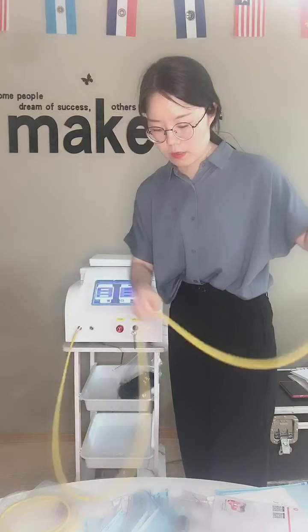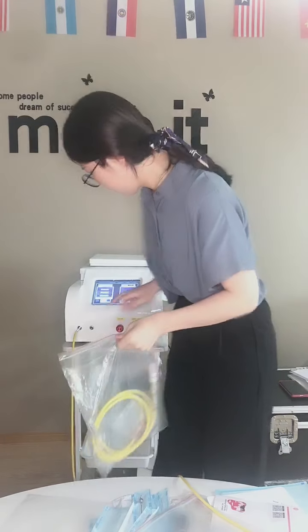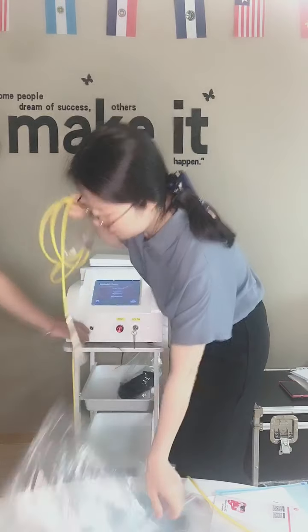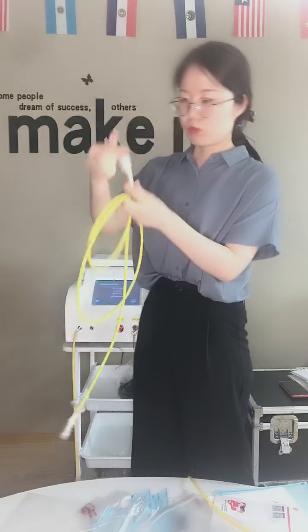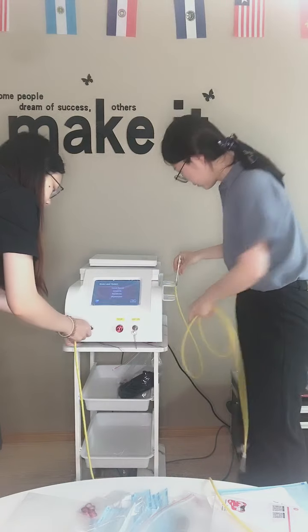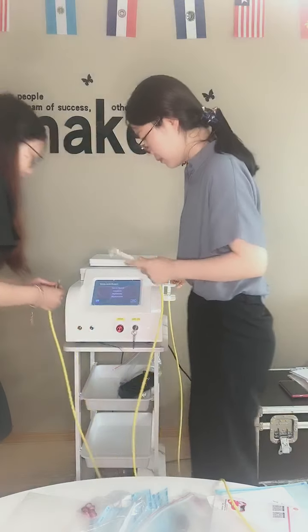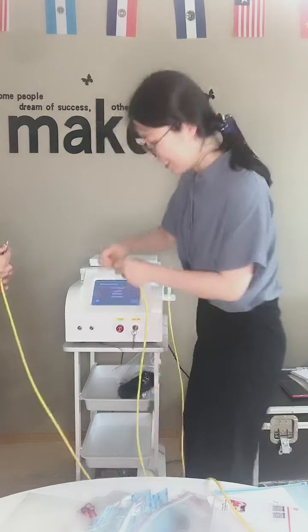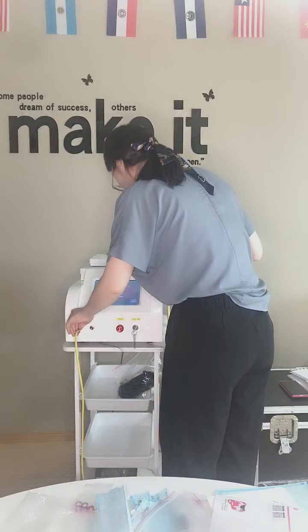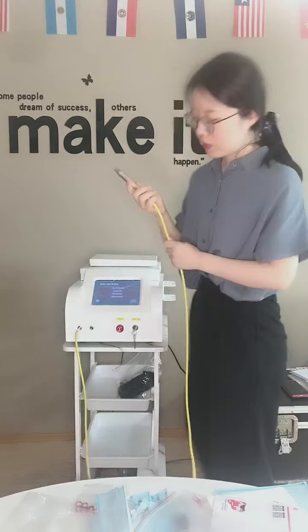Next, I will introduce you to another treatment handle. Vascular removal handpiece. Okay, also you need to remove this protector and put it on the handle holder. And next, I will install it. Okay, make it tight and keep this. This is the vascular removal handpiece.